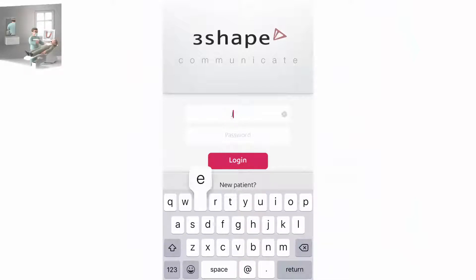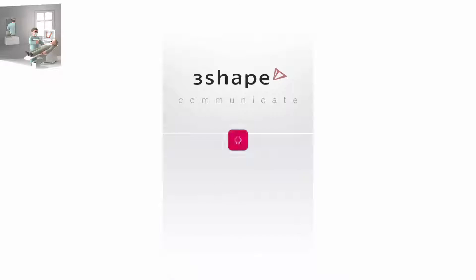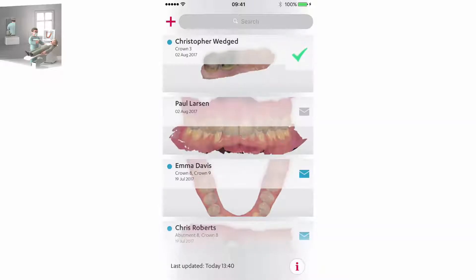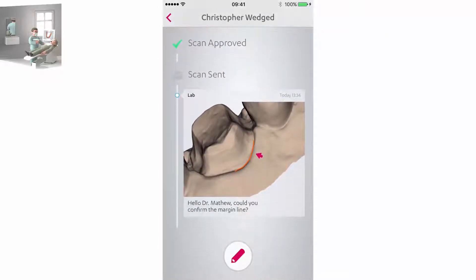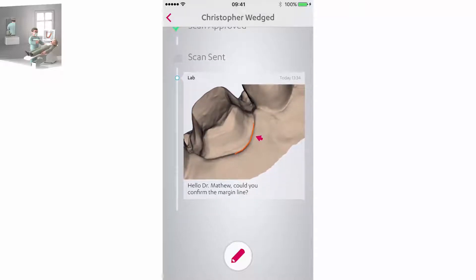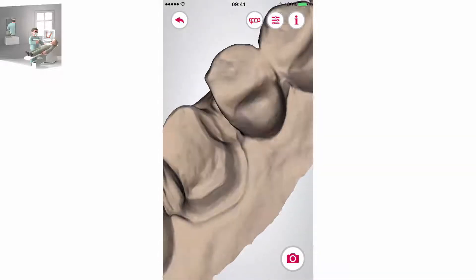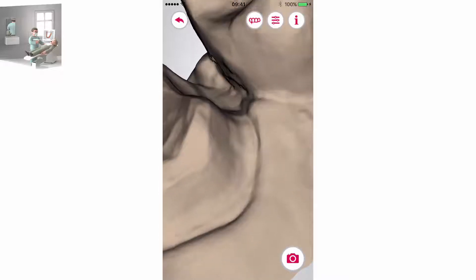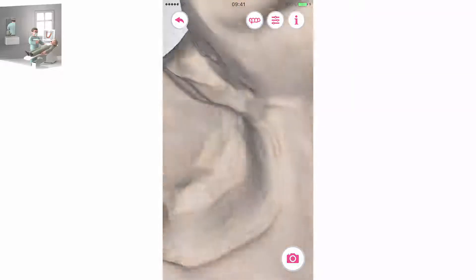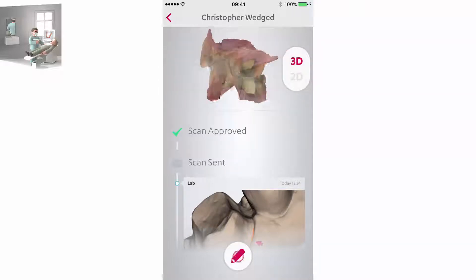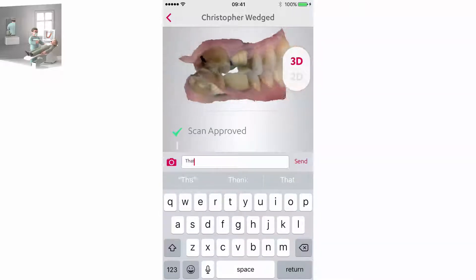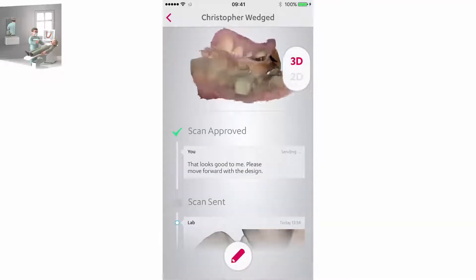Coming back to the dentist perspective, he logs into his Communicate account to see the green icon near a case signifying that it was approved for design. The dentist can also see comments added by the technician and reply. The application gives the possibility to view the picture with a comment and double-check the scan. The dentist can reply to the comment by pushing the comment button, filling in the text field, and touching send.